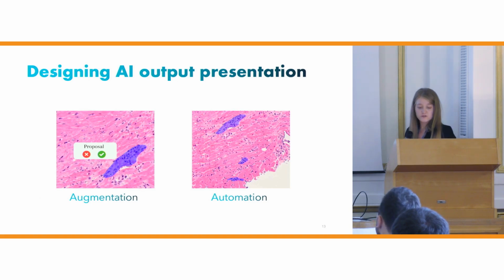The before mentioned functionalities present the form of AI implementation. The augmentation assists the user, but the final decision is on the user themselves. The augmentation shows the annotations one by one, and the domain expert decides if the annotation is right or not by rejecting or accepting it. The automation shows all annotations at once, and the responsibility of checking all of them on the specimen is on the domain expert.